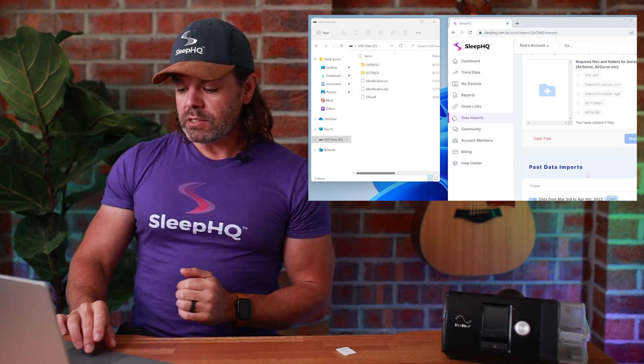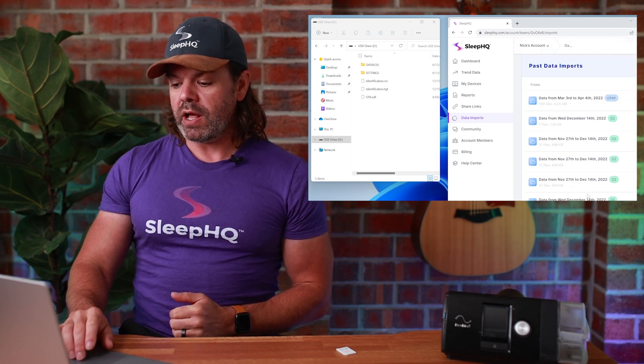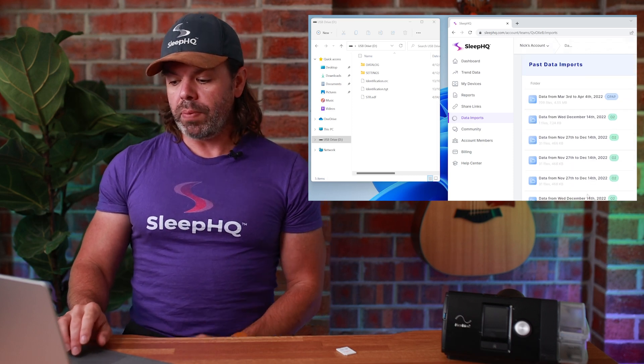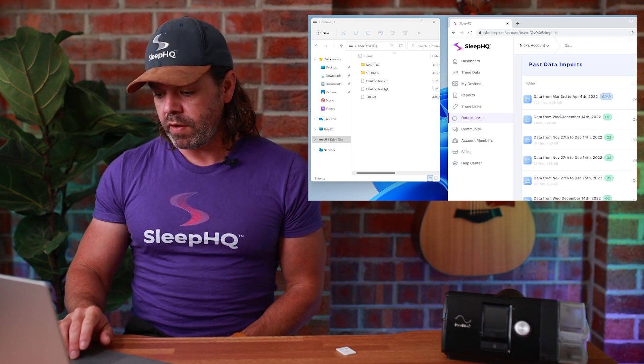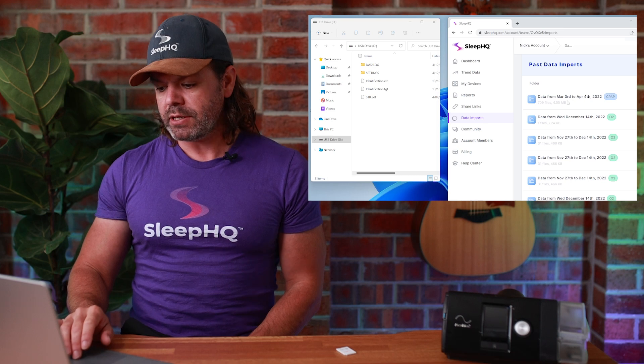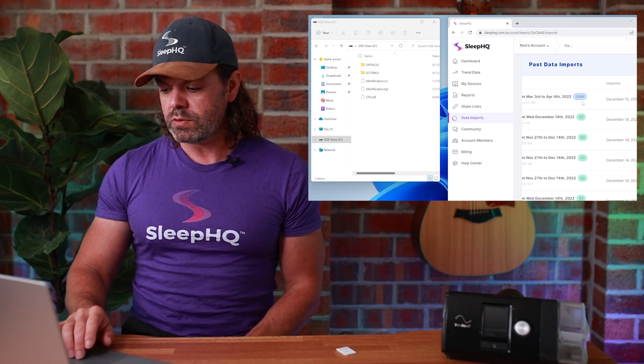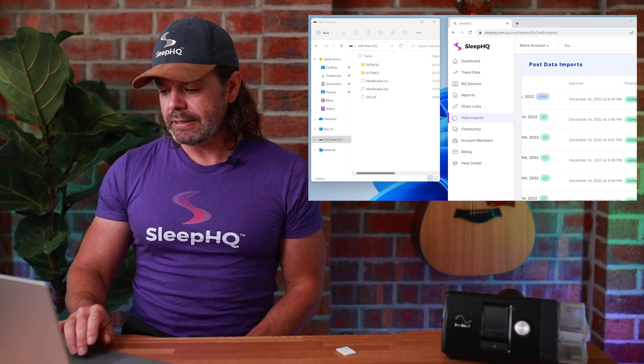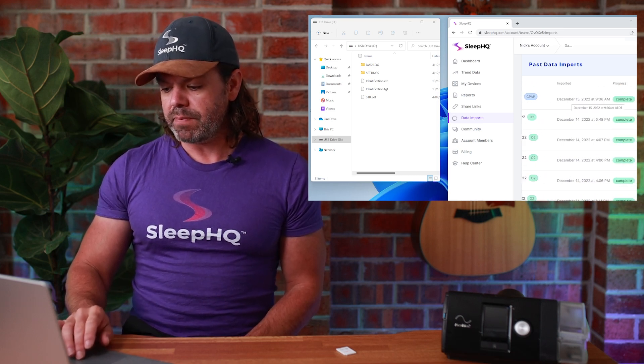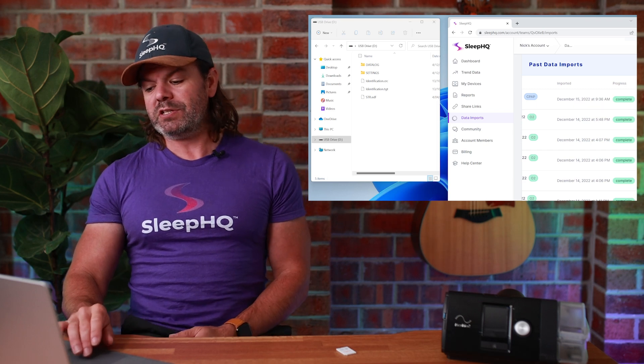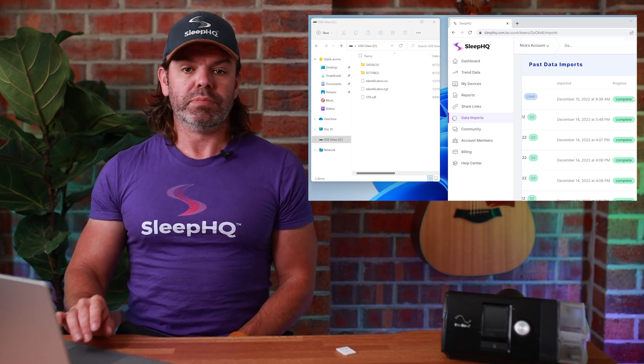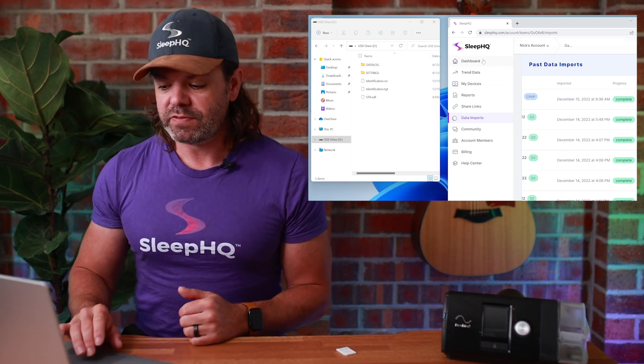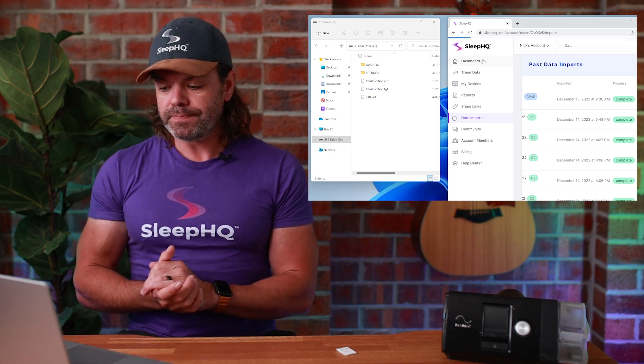But that's it. Once it's complete, if we scroll down here, you'll have a list of your past data imports. And you can see the one I've just done here data from March 3rd to April 4th, 2022 CPAP. And there it is here, December 15th, 2022, 936 AM. And it should say complete next to it. Once you've done that, you can go to your dashboard.